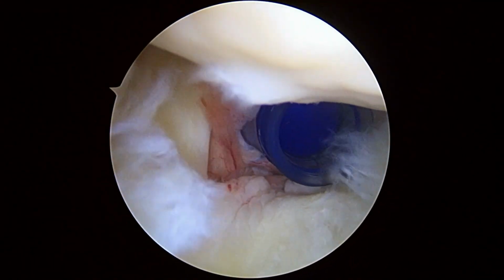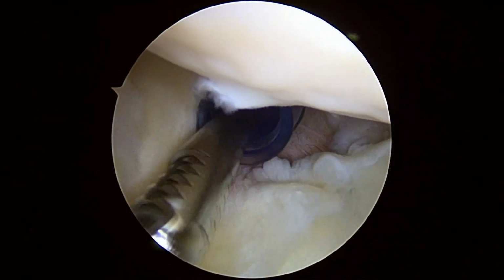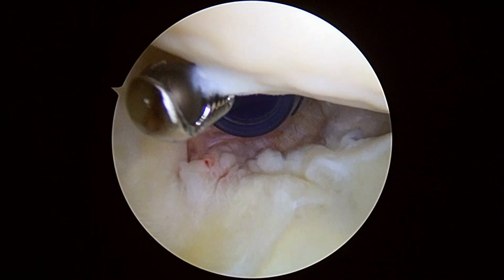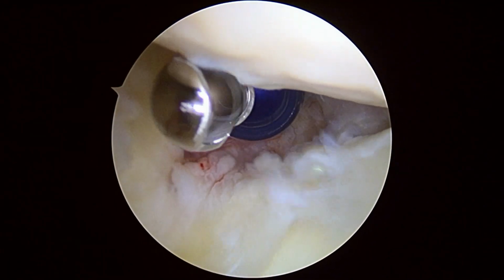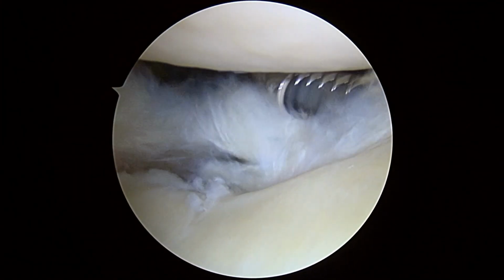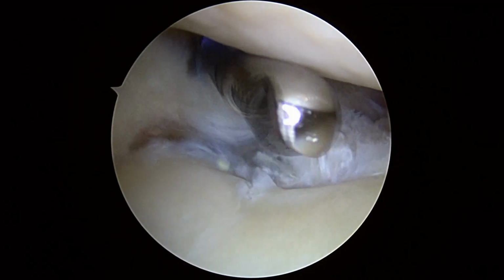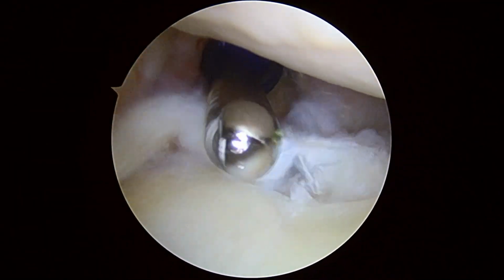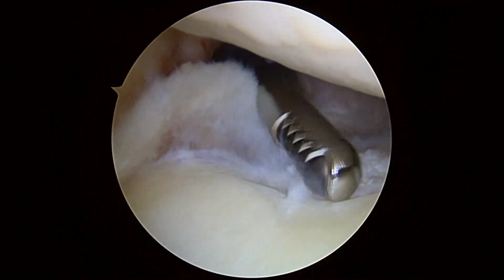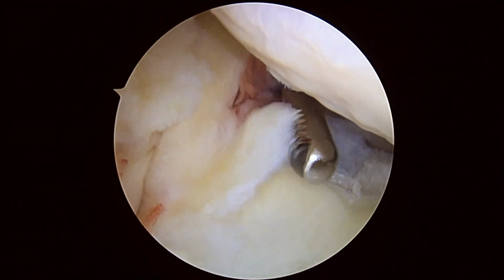Okay, hi, it's Dr. Buford. We're just getting started on the right shoulder. We're looking from the back to the front. Everything you see is magnified 30 or 40 times on the screen. Right away we can see you've got a fair amount of arthritis in the joint. You've also got this torn labrum in the front, and it extends into the biceps anchor here.